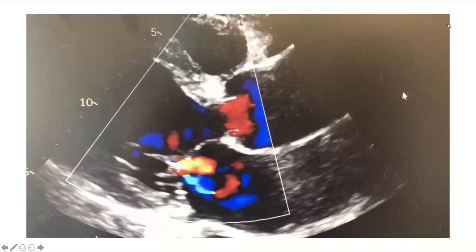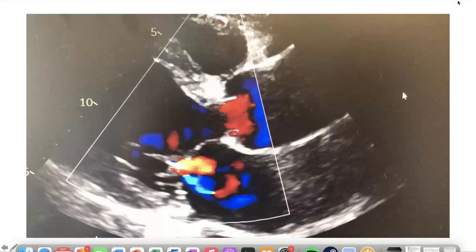Jeff, it's Kim here. Great rounds, thank you. Obviously, the current guidelines use linear dimensions. Did you see anything more about volumetric analyses as a guide as to when we might consider surgical planning? I didn't, but is that more of a shift now?